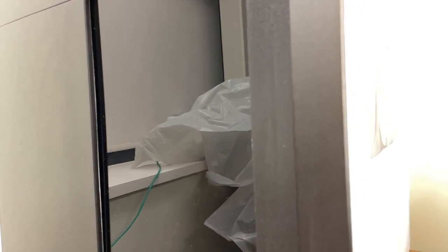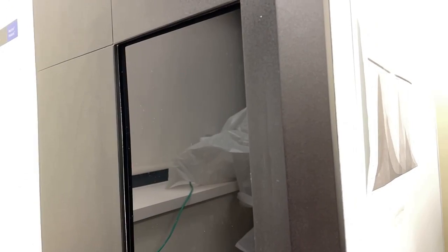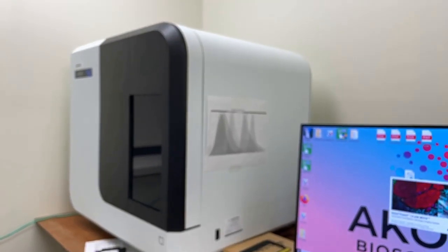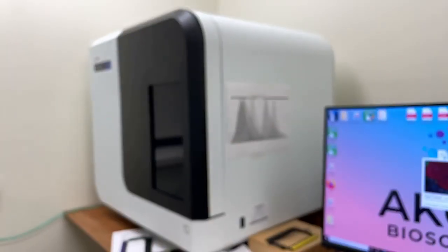What does the white box do? You put slides in these little slide carrying trays, and then you load it in, and it images everything for you. It's like the size of a mini fridge, like a computer from the 1970s that's also not in focus. It's really not in focus.